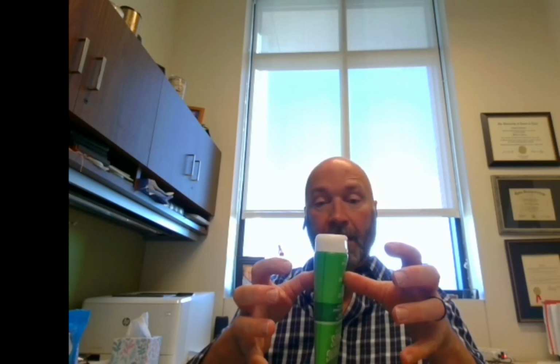So if you're the X-ray tube and I'm the image receptor, we're shooting AP, right? This is anterior posterior projection. As I oblique into an LPO, I'm rotating towards my left-hand side. My left-hand side is down.